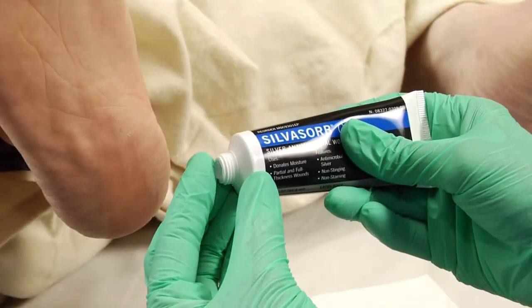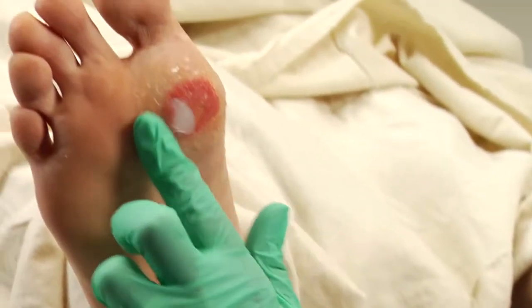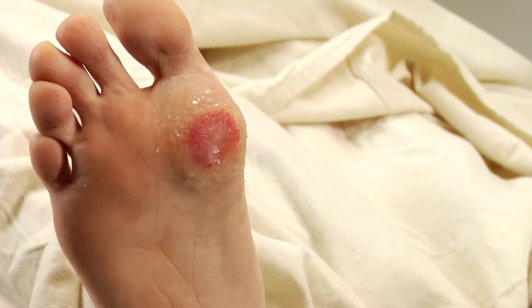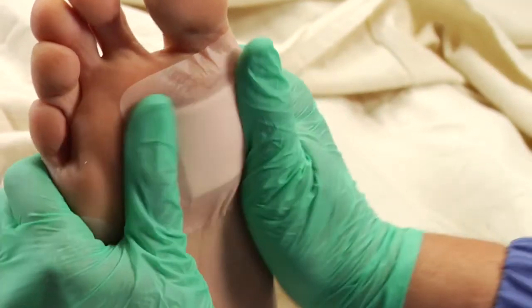To apply Silvasorb Gel, dispense it to an appropriate applicator or a gloved finger. Liberally cover the wound with Silvasorb Gel, spreading it evenly. Cover with an appropriate secondary dressing such as Optifoam Gentle.